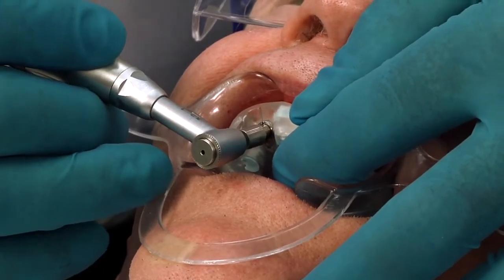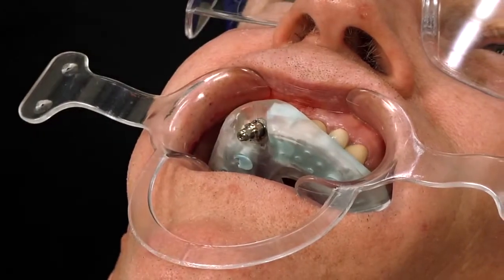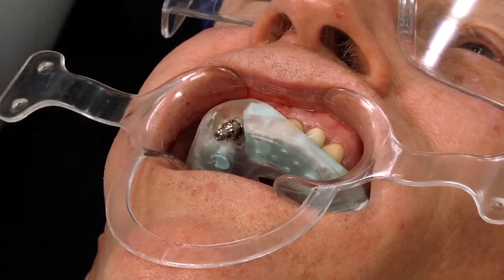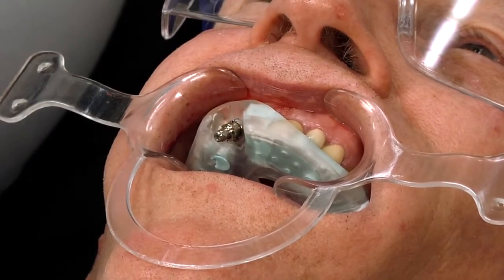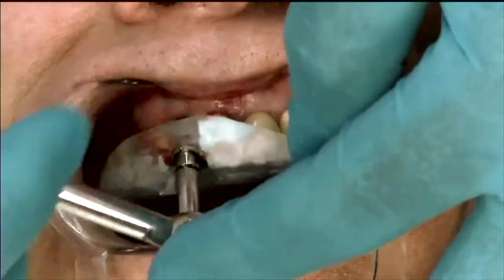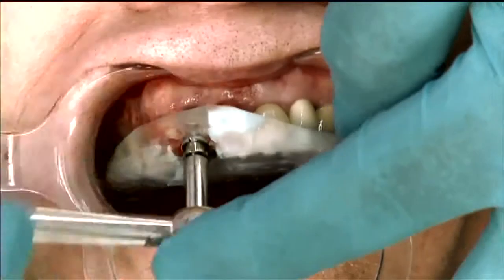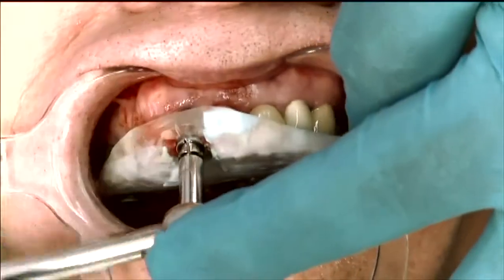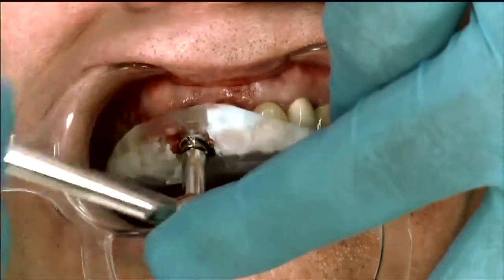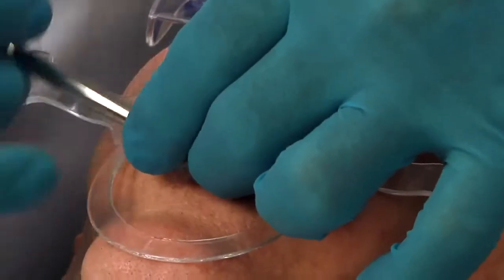You guys heard that beep and how it stopped — that means I reached 25 Newton centimeters of torque. Depending on your personal beliefs and your system that you're using, to me that is enough for primary stability. And then what I do is come in with a hand torque — this is usually when patients go, 'I have Craftsman's tools at home that we can use.' So again, we're placing it all the way in and I'm getting pretty decent resistance, so I'm very positive that we've got good primary stability.